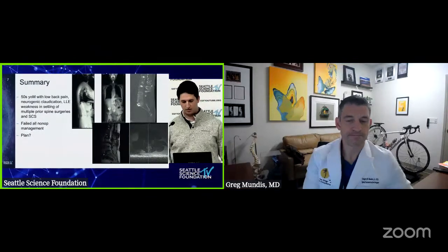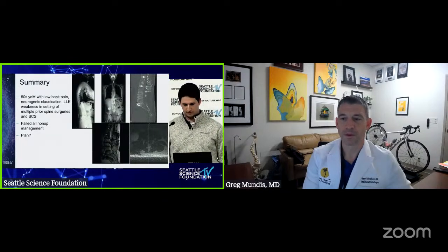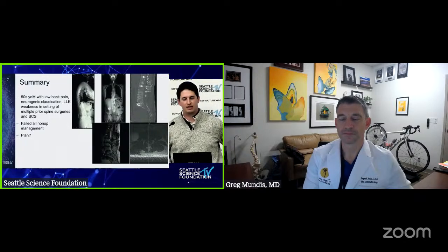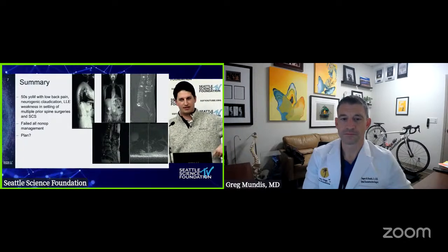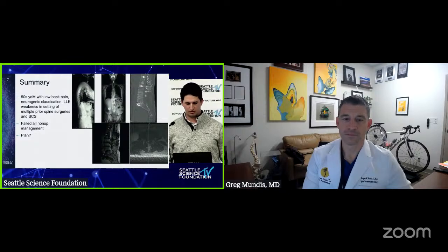Yeah, all great points. Thank you. I think for us, we certainly like to employ the lateral approaches and MIS when we can. This gentleman had it back in the 90s with a pretty large shark bite incision. I think that just steered us away from it a little bit, but I think still very reasonable. The spinal cord stimulator, we worked around and kept. And we did talk with the patient that it may not work, but we will do our best to preserve it.